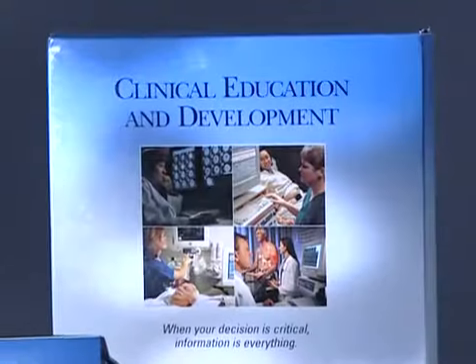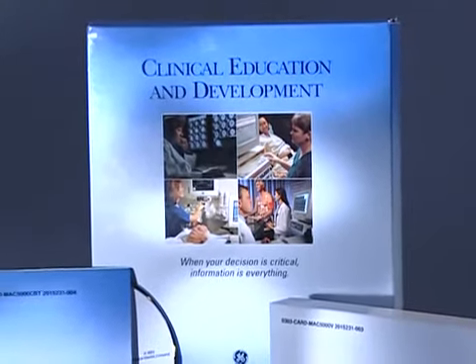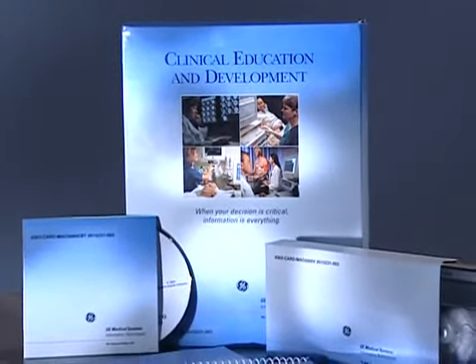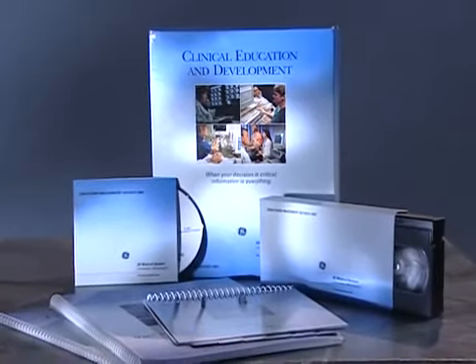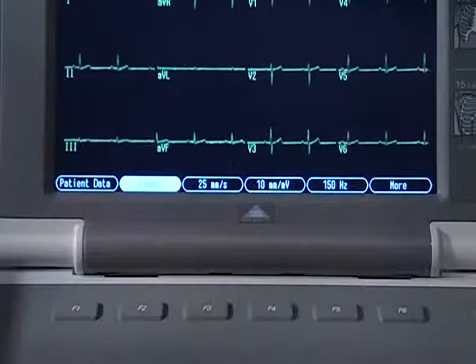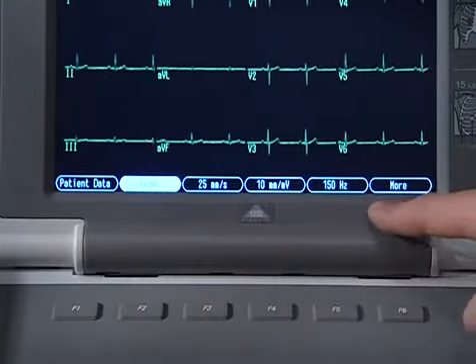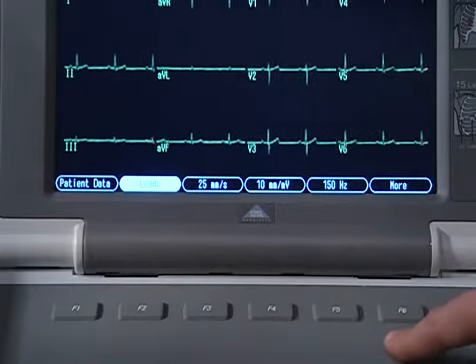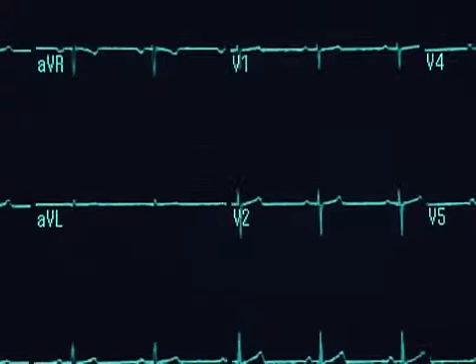The clinical reference guide included in your training kit will show you how to work within the menu selections to set up your system. In this video session, we will review how to select and access menus and work with data fields. The menu selections on the screen correspond to the function keys directly under them on the keypad. To make a choice, press the function key beneath the menu item you want. We will review the F keys briefly.